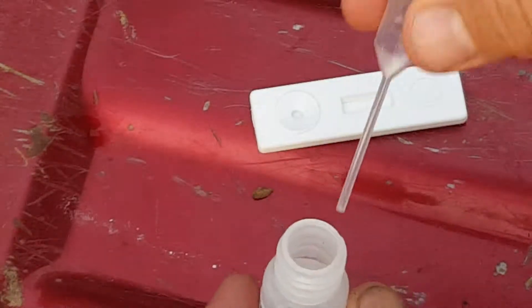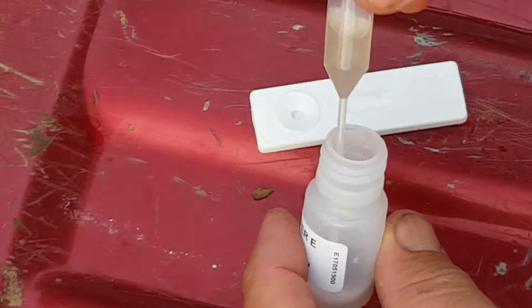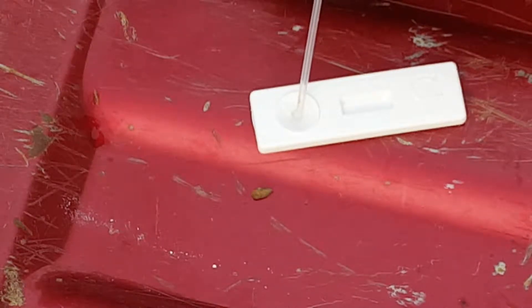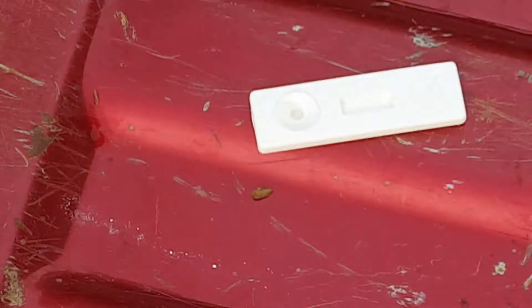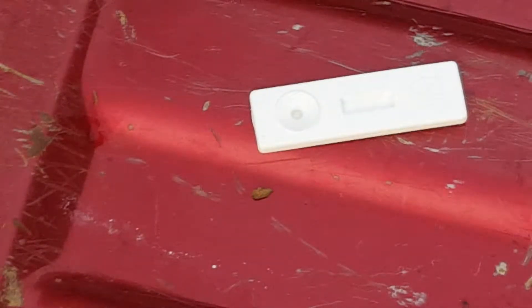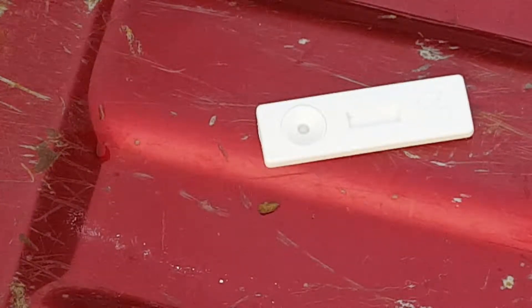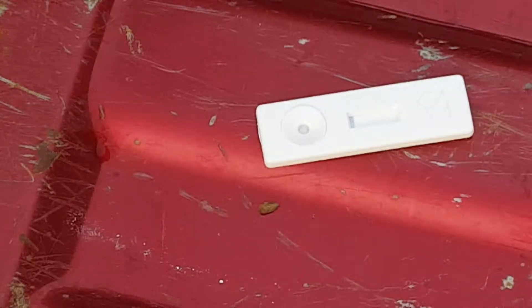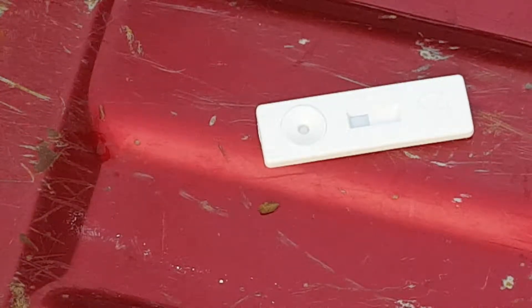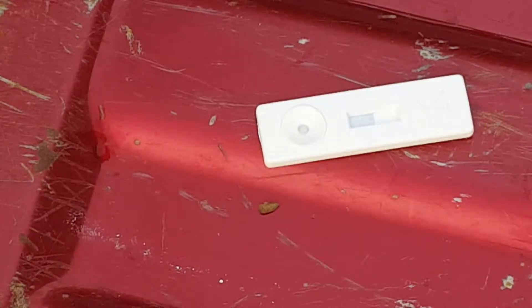Alright, nice and close. Put your dauber in there, get a nice little solution — you can kind of see it floating around in there. Put two drops, maybe three, right there in the middle. Take your dauber, put it back in. Place the cap, and as you're waiting, jiggle everything around. Start putting the stuff back in the bag. Now you can see it's starting to come across — this is the test line and the control line. The control line usually shows up really well right away.